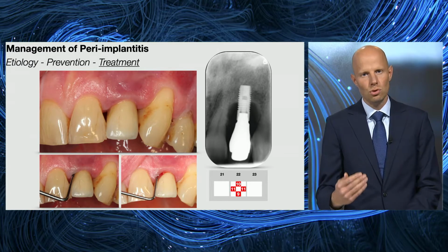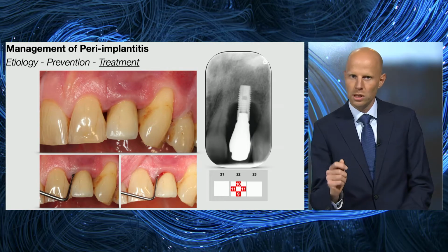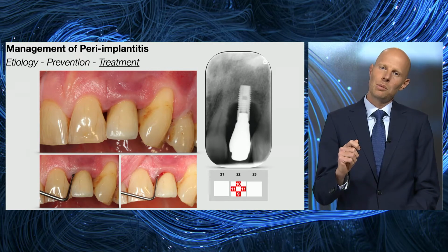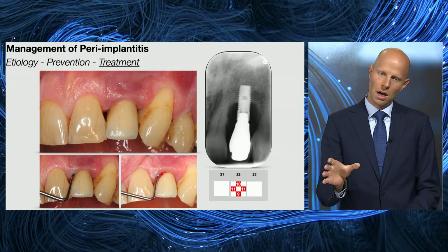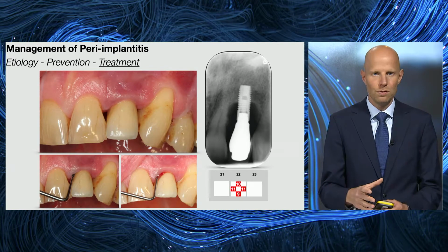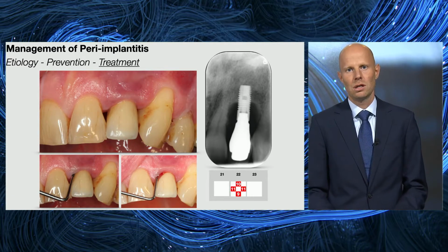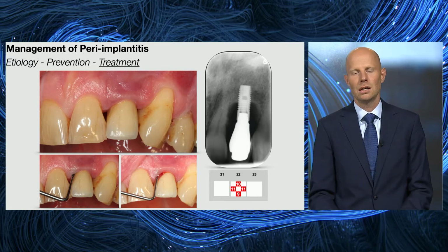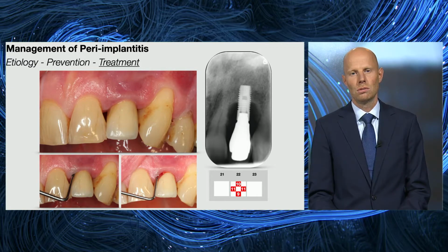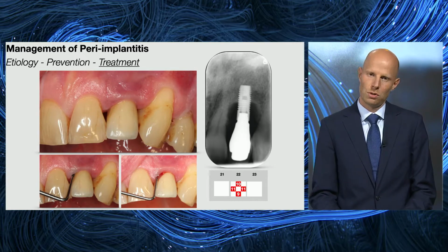Surgery is usually required, and this is what I would like to address. But please, don't get me wrong. The patients still undergo non-surgical therapy. We give time for healing, but we also give the patient the understanding that in a second stage, surgery will be required. Whenever possible, we remove the superconstruction.